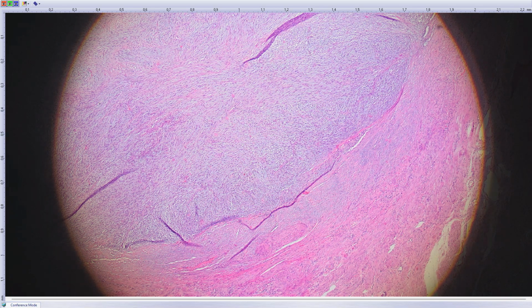And the preferred diagnosis by the referring pathologist was high-grade endometrial stromal sarcoma with BCOR amplification or fusion, and indeed by NGS we found this very common BCOR ZC3H7B fusion. So the diagnosis is high-grade endometrial stromal sarcoma with BCOR fusion.